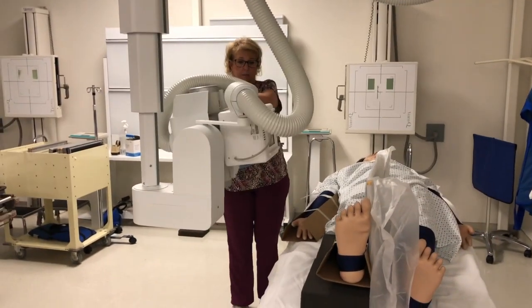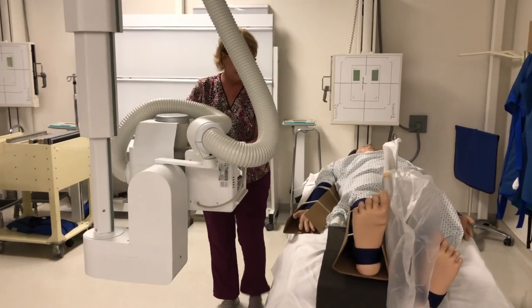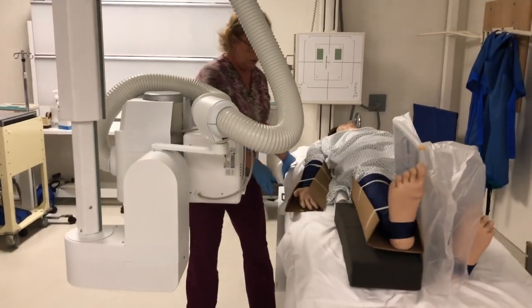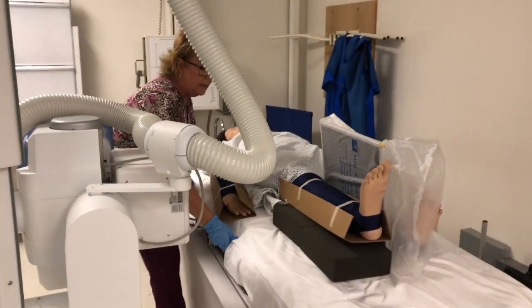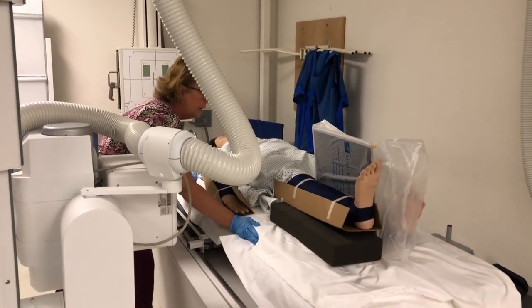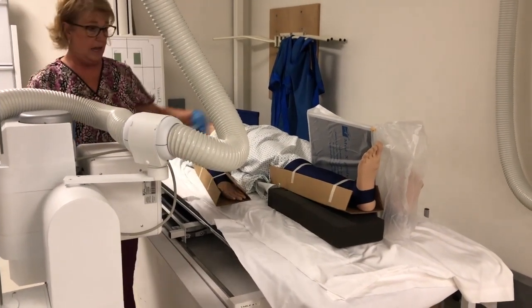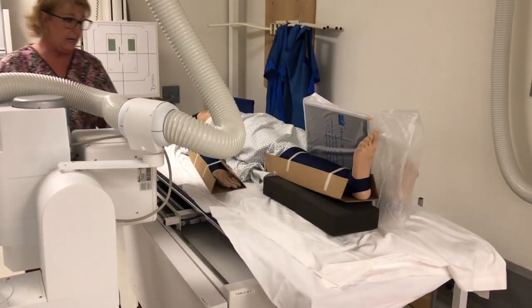All right, so now we're moving this into place. I'm gonna try to get 40 inches if I can. So I'm gonna move this back as much as possible. Maybe slide the backboard if I can to try to get 40-inch SID.